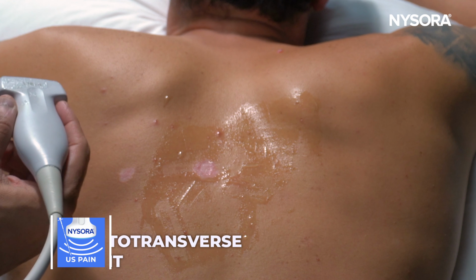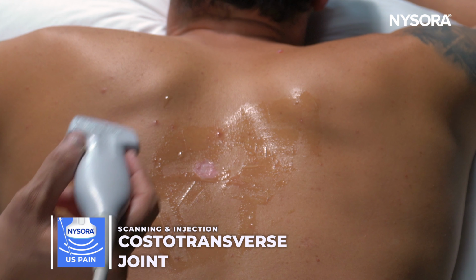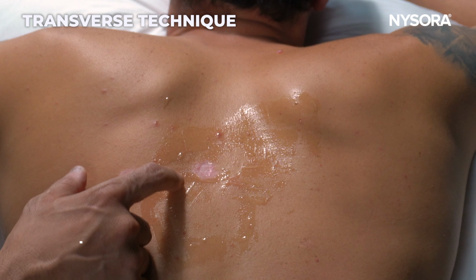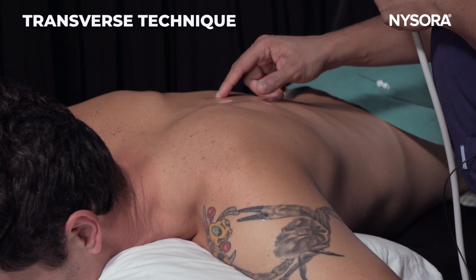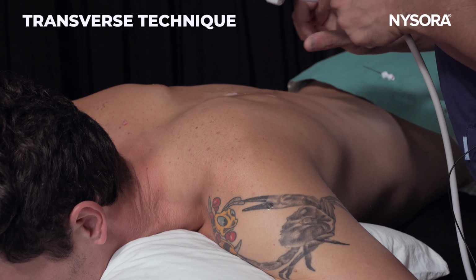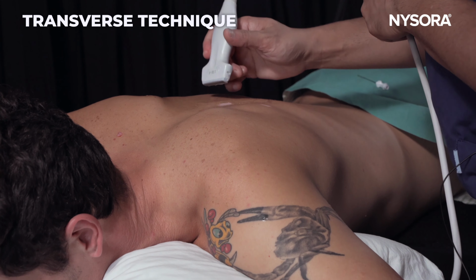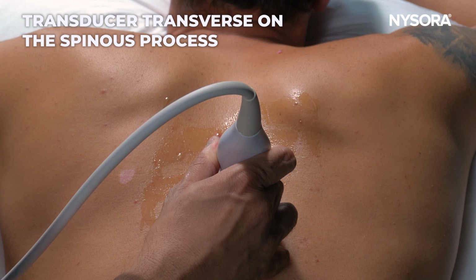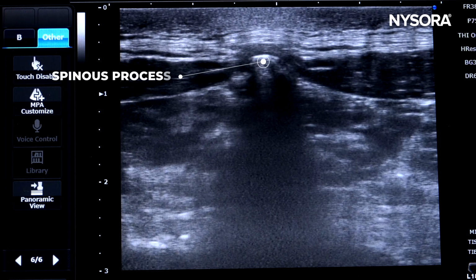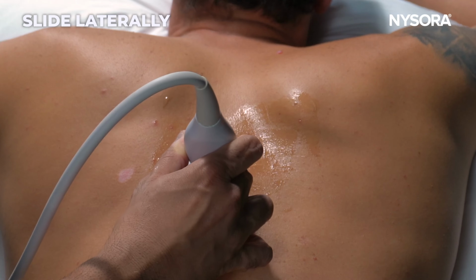I'm going to talk to you about the costotransverse joint injection. This could be one of the sources for posterior thoracic paraspinal pain. To do this injection, you will start with feeling for the spinous process, and you will put your probe horizontally or transversely on the spinous process. As you could see in the image here, the spinous process is nicely seen. Then you will move laterally.